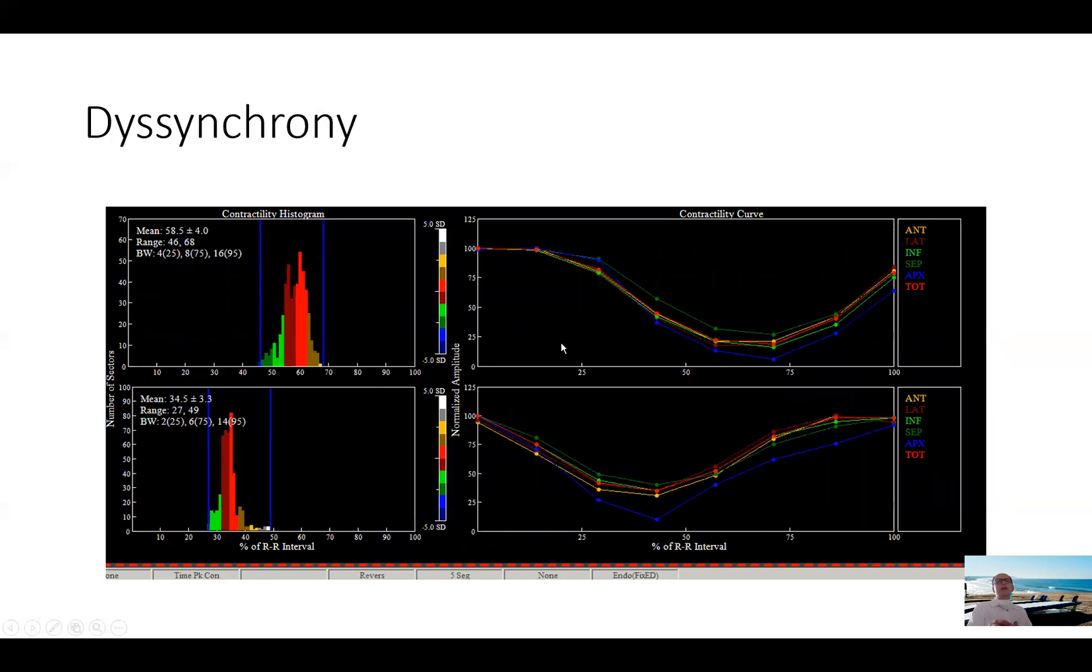Next, which is still in the realm of, despite the data here, is still in the realm of research and fancy things we do, we look at dyssynchrony imaging. This is dyssynchrony at rest and dyssynchrony post-stress. The most important number to look at is here the standard deviation of the mean of the synchrony and anything below eight usually is normal. So you can see here all the segments of the heart are contracting all almost at the same time and relaxing at the same time, both in the rest images and the stress images.